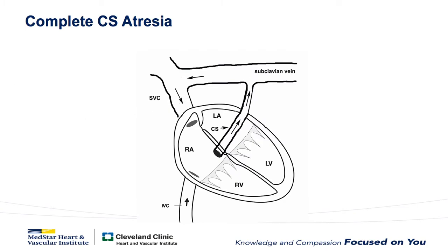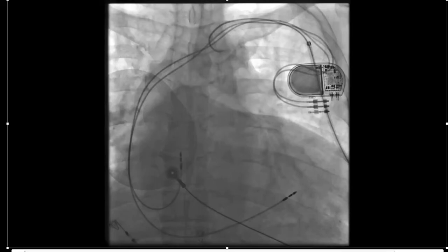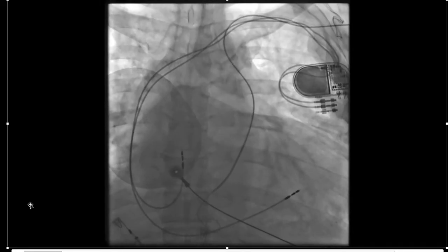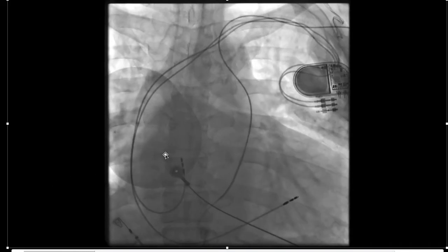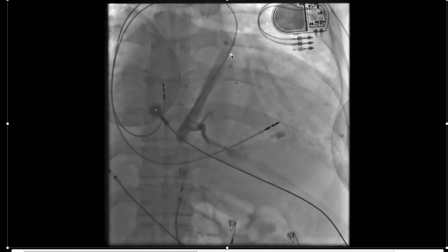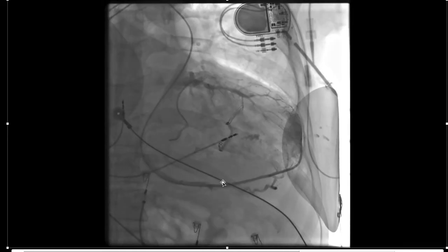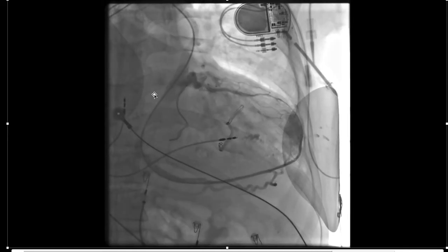If you know this, then you can look for the persistent vein of Marshall when you can't find the coronary sinus, as illustrated in this patient, where you can see there's a relatively large persistent vein of Marshall and complete CS atresia.